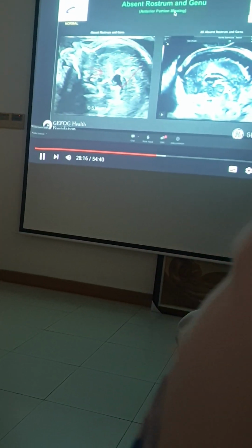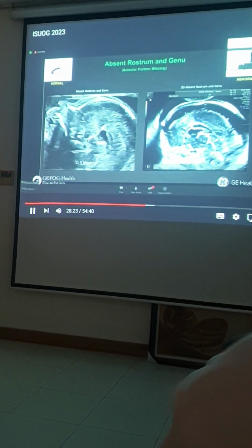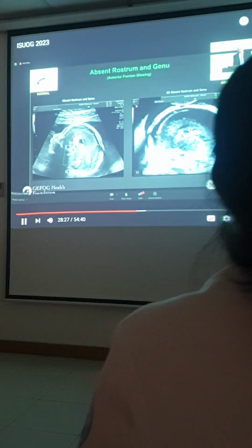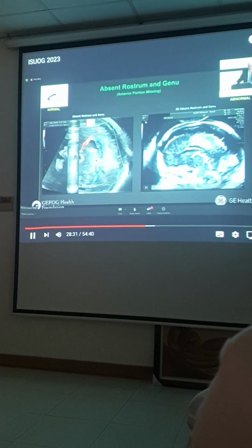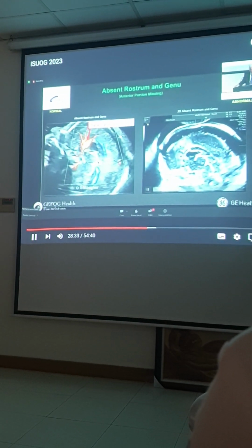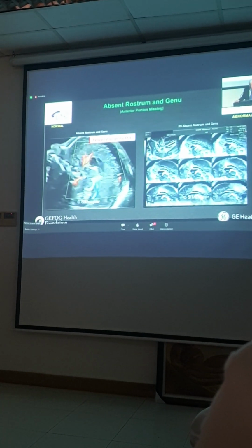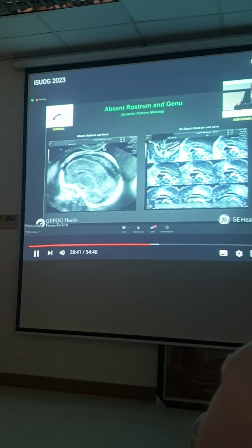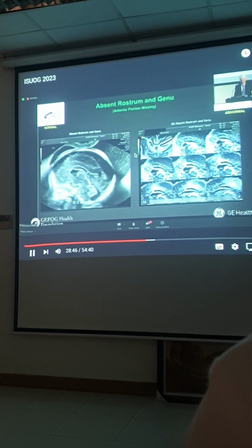The next step on your first path is to take a 3D volume with VCI. And taking a 3D volume with VCI, you can appreciate the corpus callosum is present here, but it is absent here. When you look at the pericallosal artery, you'll see that looks like an entirely normal distribution, but if you look a little bit more closely, you can see there's fenestration of the anterior part of the pericallosal artery. These are far more challenging diagnoses when you're looking at segmental partial agenesis of the corpus callosum.